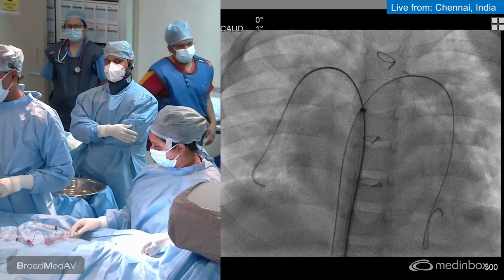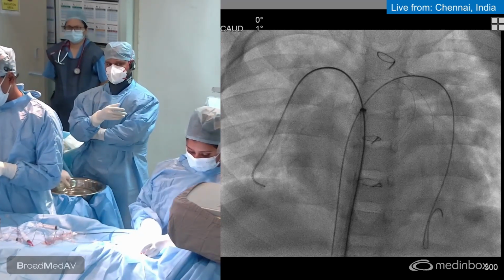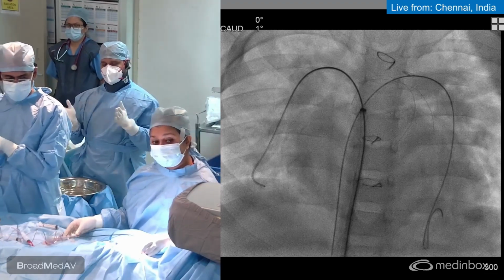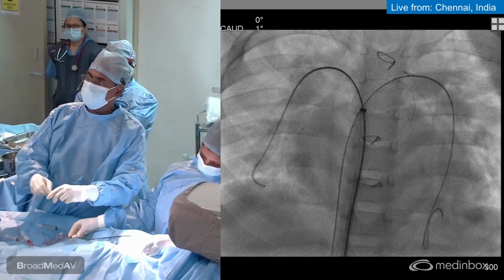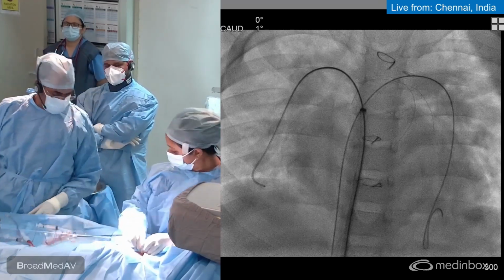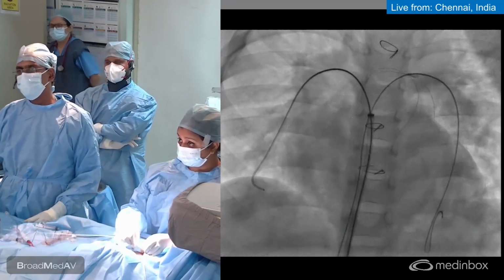Okay, so you mean to say that the narrowing was more anteroposteriorly? Yes. So it was like an oval lumen. Yes, sir. Even on the left side, it was the same. The compression was like an oval narrowing. So this is sort of a flattened profile that we are getting. Yes, sir. I agree with you. I think that is where the importance of three-dimensional imaging is very vital.